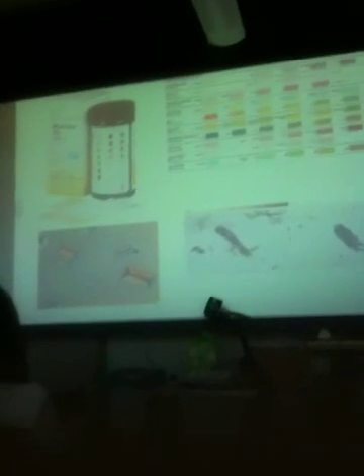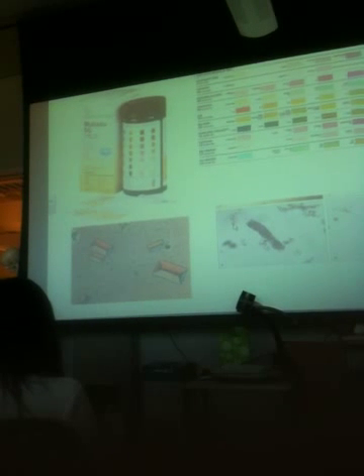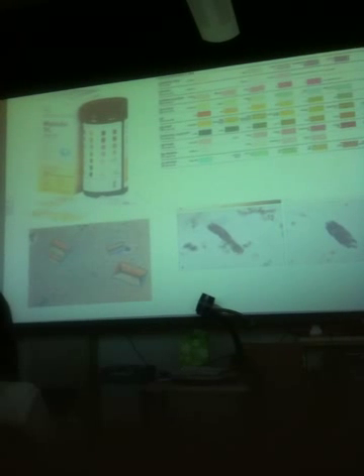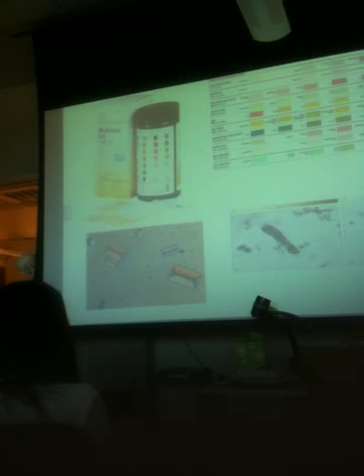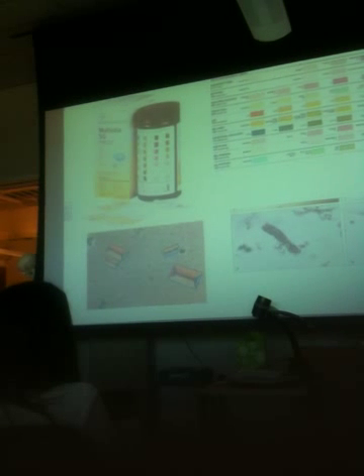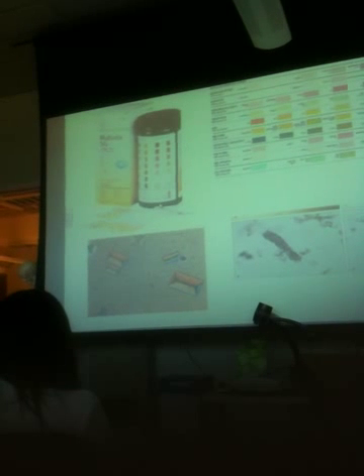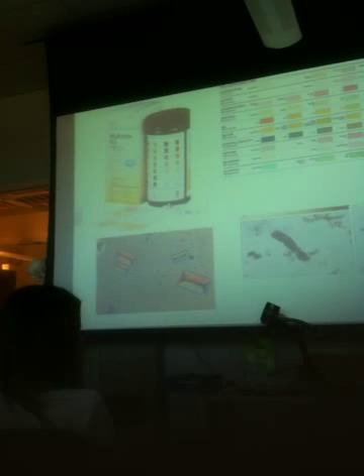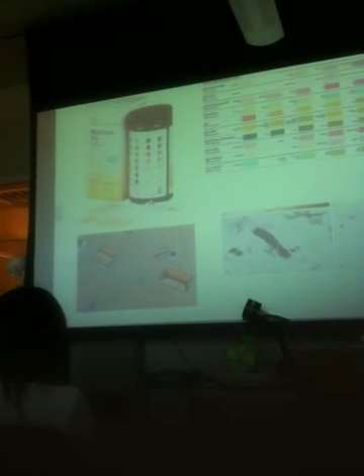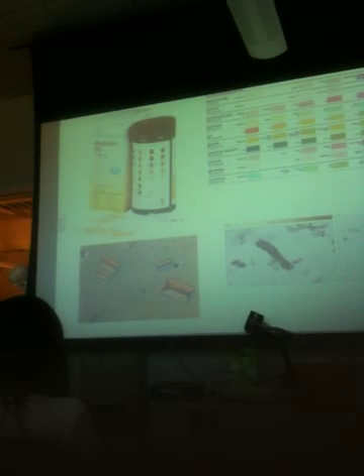Okay, so remind yourself about these lab sticks. This is just some pictures of different urinalysis stuff we did. You're not going to need to read the labels, but you ought to know what we tested for using these. What are some of the tests that we use this for? Glucose. Phosphates. Nope, we didn't use this for phosphates. We did it by the tube method. pH? No, not phosphates. Protein. What else?